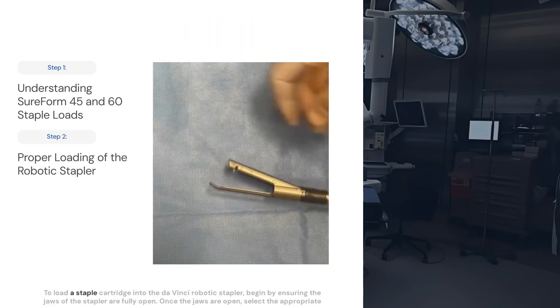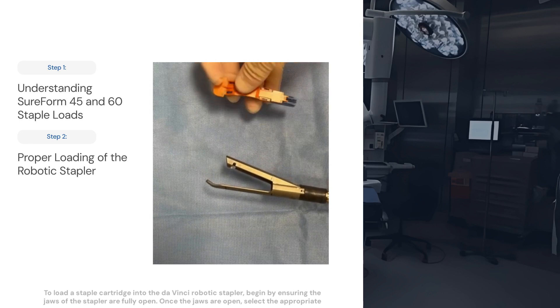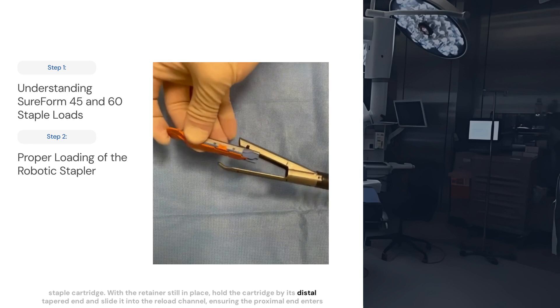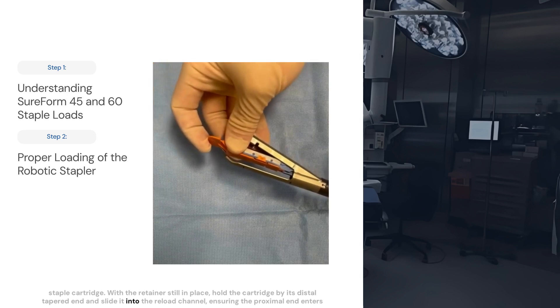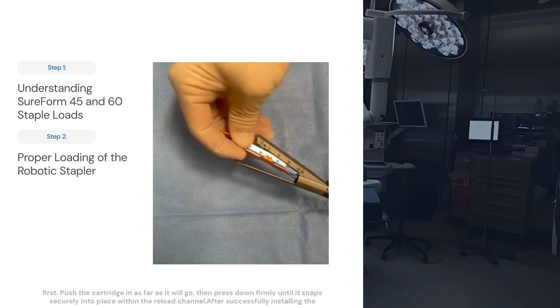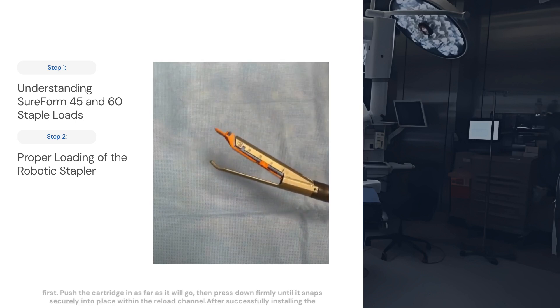To load a staple cartridge into the DaVinci robotic stapler, begin by ensuring the jaws of the stapler are fully open. Once the jaws are open, select the appropriate staple cartridge. With the retainer still in place, hold the cartridge by its distal tapered end and slide it into the reload channel, ensuring the proximal end enters first. Push the cartridge in as far as it will go, then press down firmly until it snaps securely into place within the reload channel.